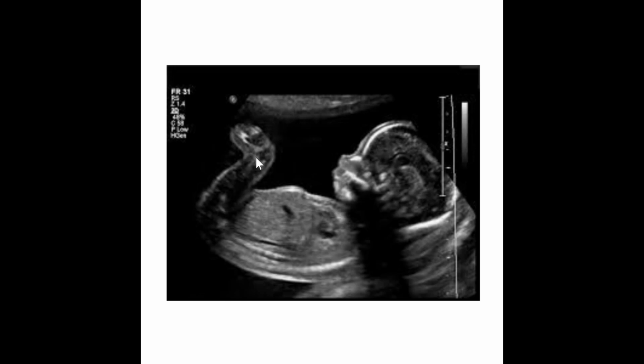We can actually see some of that hypoechoic part here. We've got the leg, this is the knee, femur along here. We can still see some echoes in here, but this area is a lot darker than what we would expect. So this is a hypoechoic area where this is producing more of an anechoic area. And shadowing can take on either appearance. Oftentimes it takes on more of that anechoic appearance.